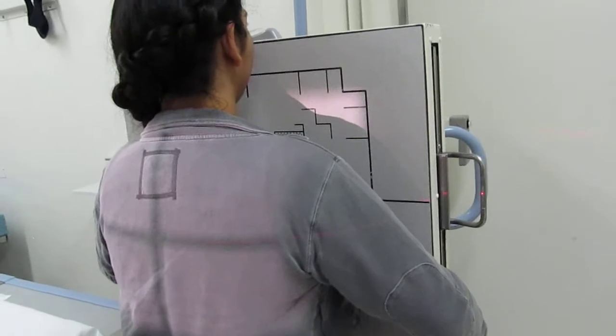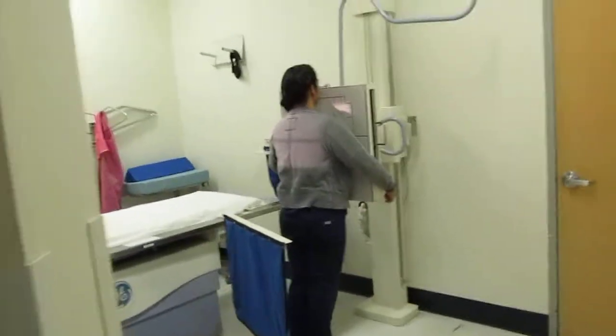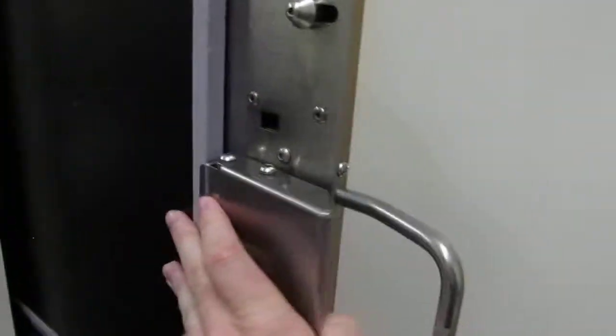Okay, so get shield. Okay, so I'm back over here and everything's ready to go. Breathing instructions are Jane, go ahead and take a deep breath and hold your breath, and I would shoot and breathe. Jane. Okay, you can relax your arms. I would take this out. And in theory, I would ask Jane to position for the next x-ray.